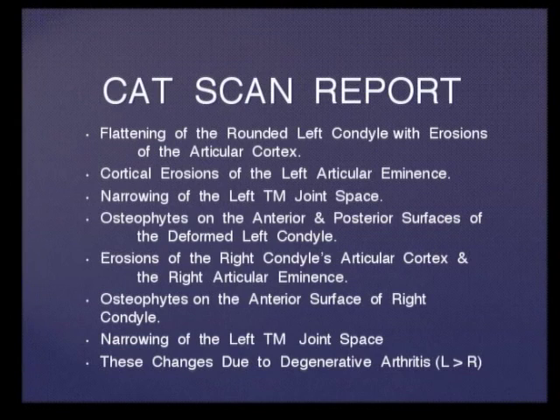And we document each and every one of these patients with an MRI report. When they have a deep brain stimulator implanted, it's very difficult to obtain an MRI. And so we use a CAT scan, which is what we did on this patient.